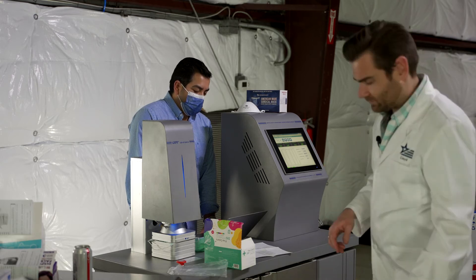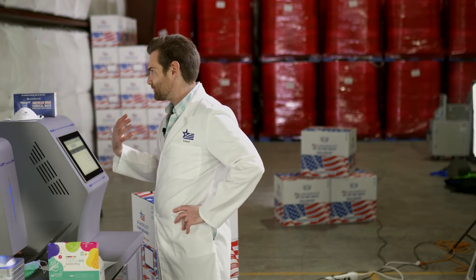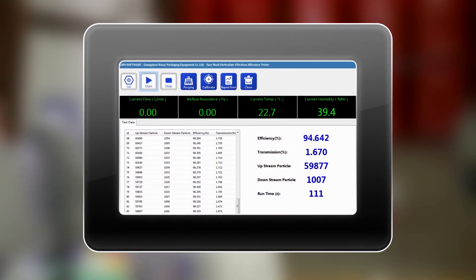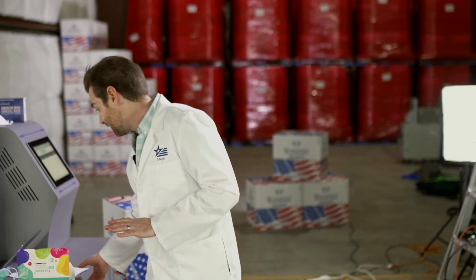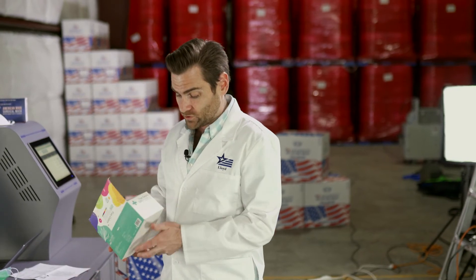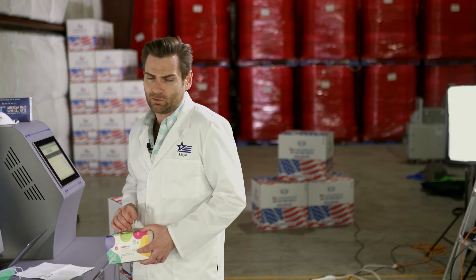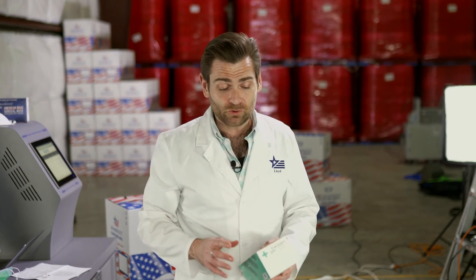I'm going to guess 95 — great guess, you're getting good at reading my face. The result is 94.642. These things are going to vary by a couple of percentage points, so I'll give them 95. They claimed 95 on the box, which matches. However, on the Amazon listing the manufacturer is claiming 98, and I'm calling that out — that's not right. It is 94.6, not 98.